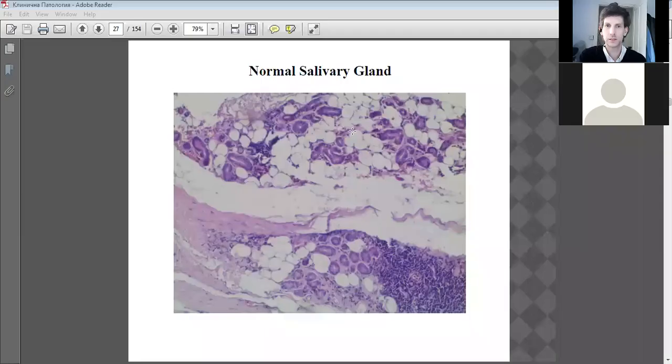So I've set it to record. And yes, shall we continue with yesterday? Sure, no problem. Can you see the slides yet? Not yet. Not yet. Can you see them? Yeah, I can.